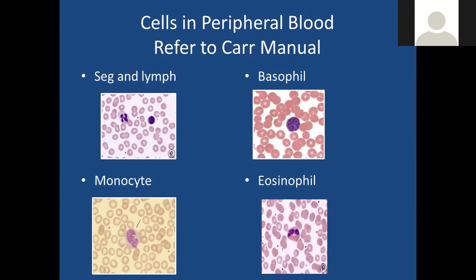All right, what else does it have? Most of the cell is comprised of nucleus, right? It has a very high nucleus to cytoplasm ratio. But take a look at your size. It's relatively the same size, maybe just smaller than your neutrophil. So it's definitely not a blast.